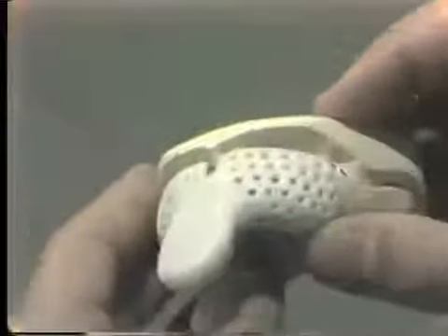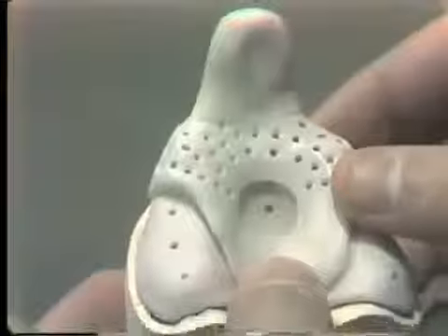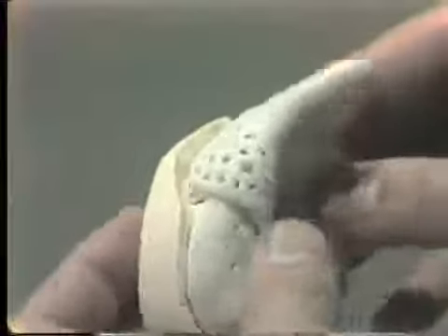And it is perforated with numerous holes in order to mechanically lock the alginate, which we use to make this second impression. The holes act to lock the alginate to the tray so that the alginate does not pull from the tray when it is removed from the mouth.